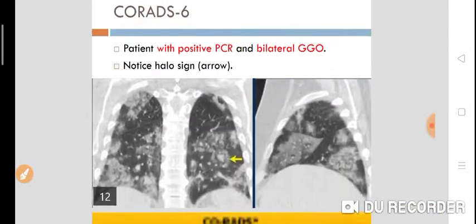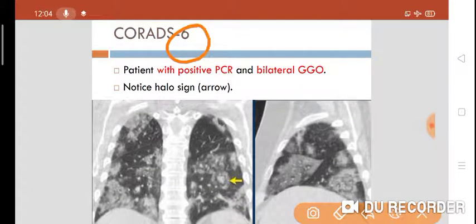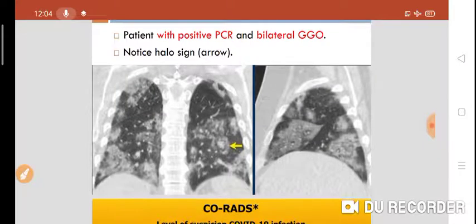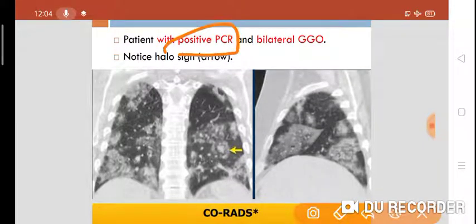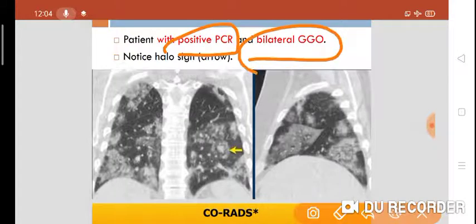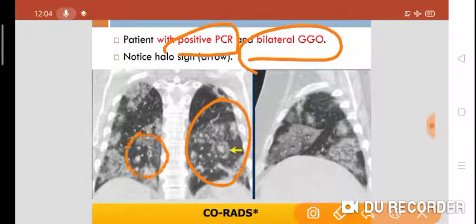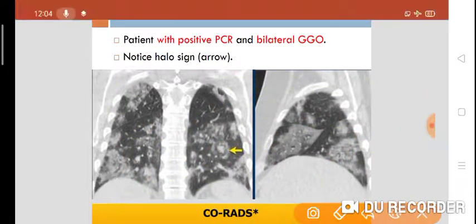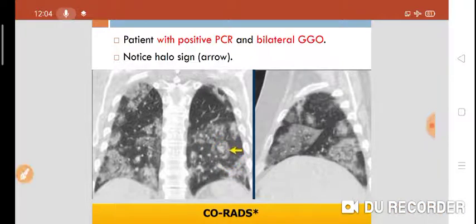CO-RADS score 6 means there is no doubt — the patient has a positive RT-PCR with bilateral ground glass opacities. A 'halo sign' is visible on CT, indicating development of pneumonia with bilateral ground glass opacities. This is a clear-cut case of COVID-19 illness.